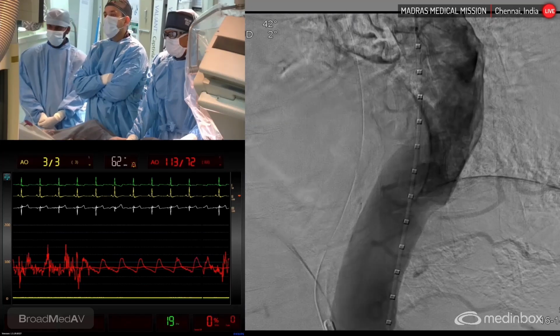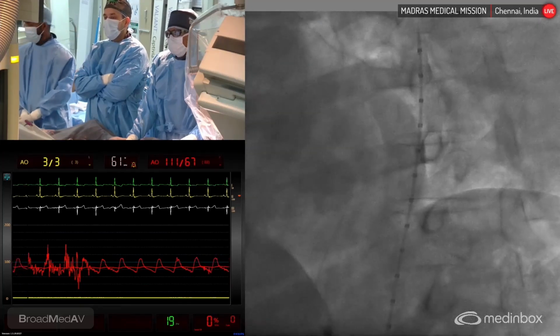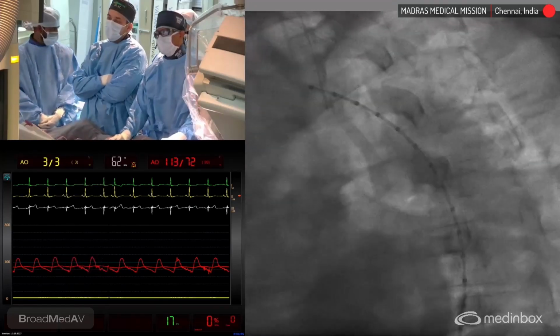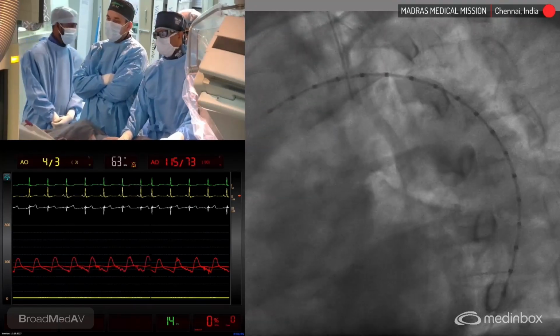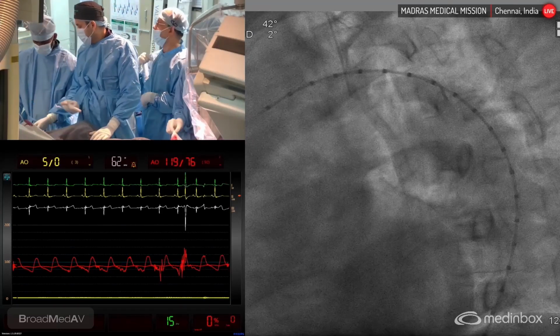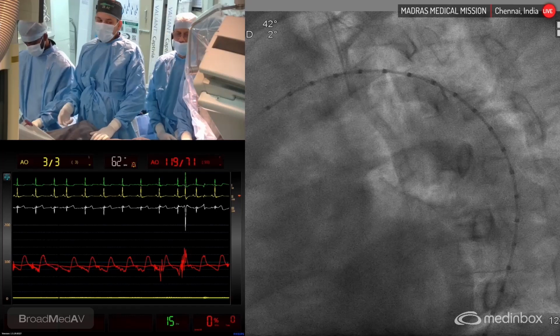Okay, deactivate the DSA. Show me above. Okay, let it be here. Let's start upgrading our device size.